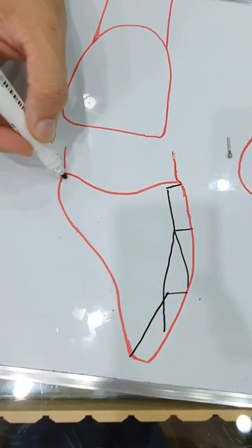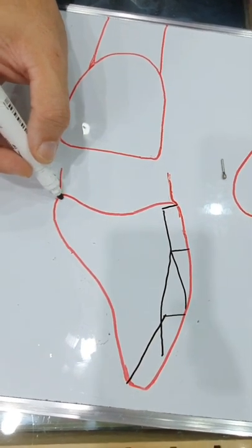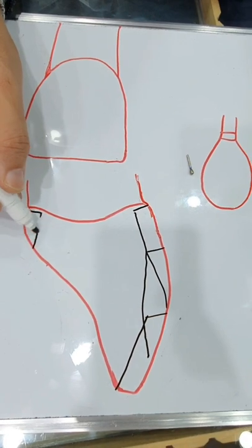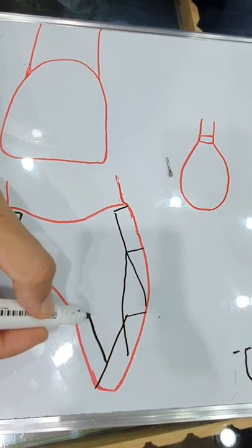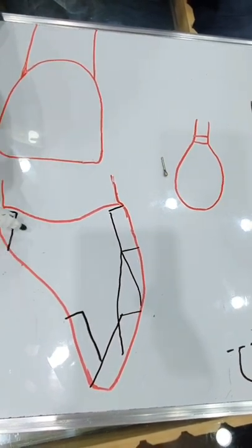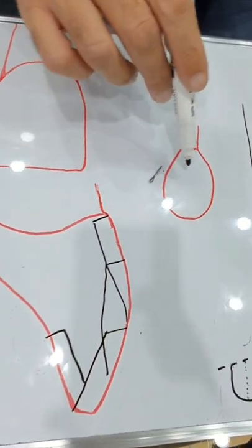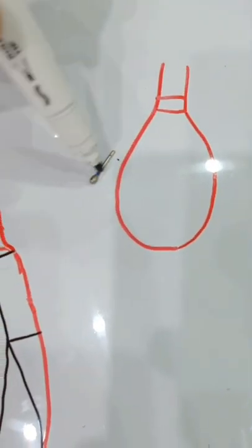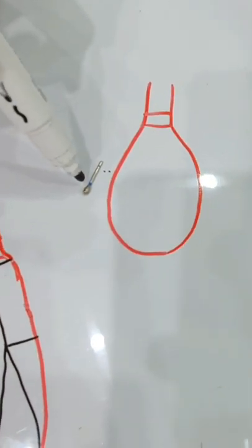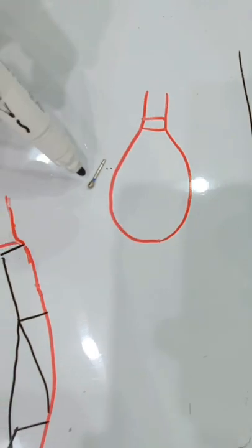On the lingual, it's a little complicated because you're no longer dealing with only convex surfaces. So here you would start out the prep like this with the same shoulder prep burr. Here you can also do the same thing with the shoulder prep burr, but this concavity and then slight convexity poses a problem. So the solution I have found is this burr that you see here on your right side. This is the outline shape. It's kind of like a balloon or like a ball, and it is made of diamond. You can have again the same consistencies as extra coarse, coarse, medium, fine, or extra fine. I like to use coarse and occasionally extra coarse, and this works good for me.